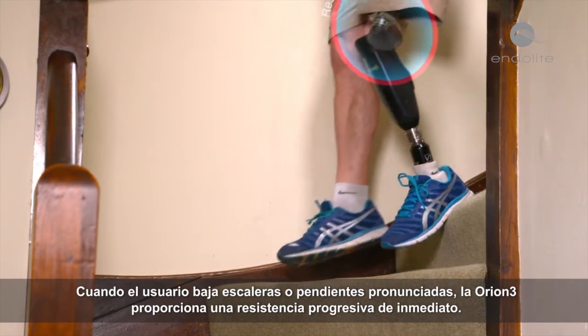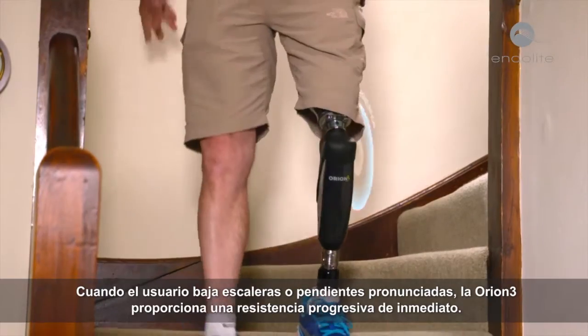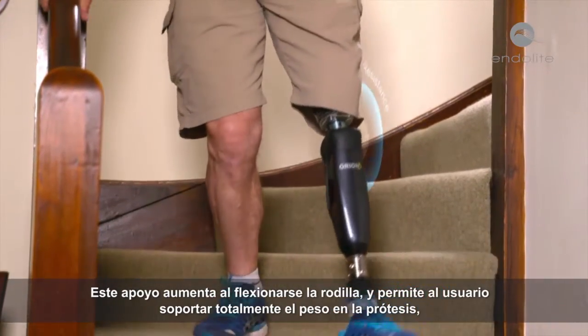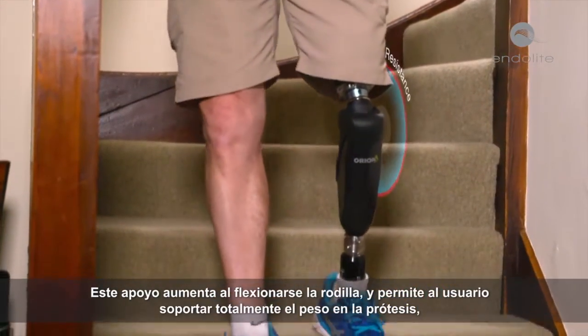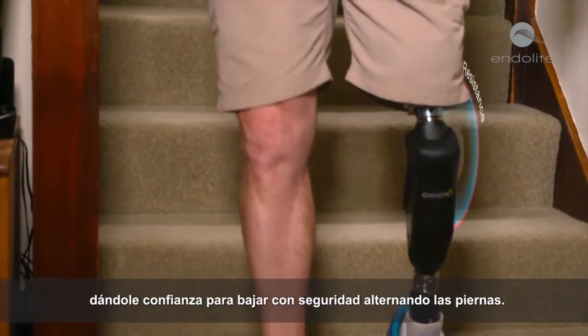As the user walks down stairs or steep slopes, Orion 3 immediately provides progressive resistance. This support increases as the knee flexes and allows the user to fully weight bear on the prosthesis, giving them the confidence to safely descend step over step.